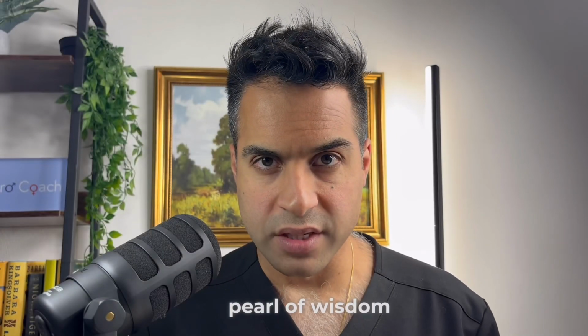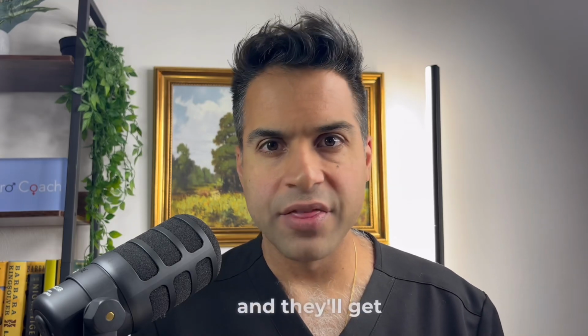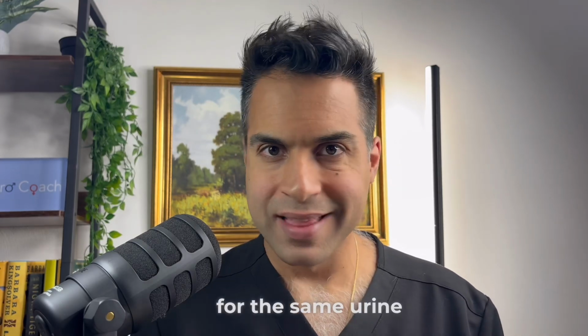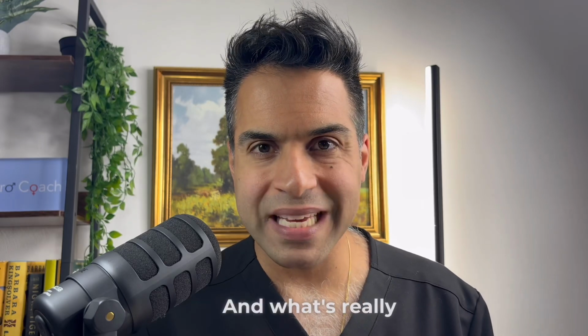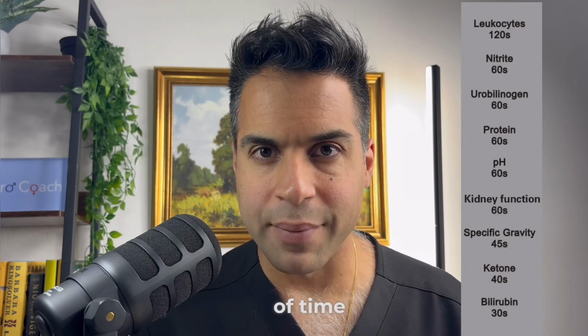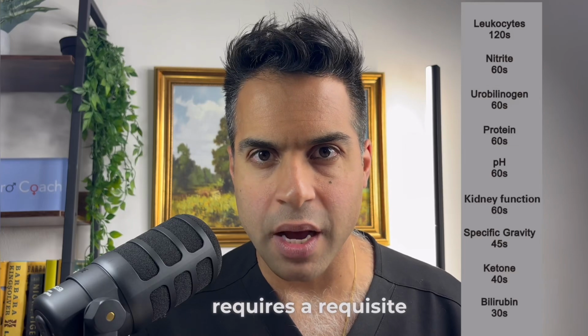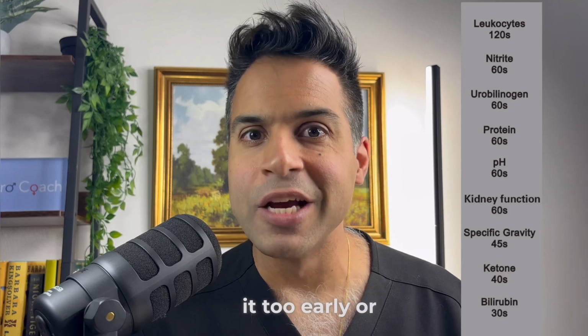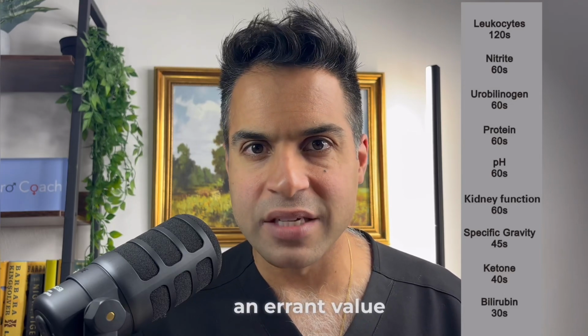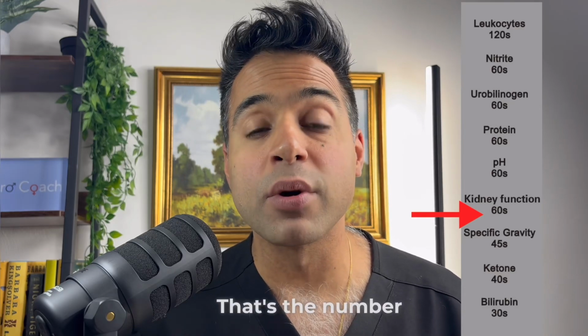And this is my pearl of wisdom. So when you see a urine dipstick, some people will look at it and they'll get multiple different values for the same urine specimen. And what's really key is if you look at this diagram here, you have to make sure you wait the right amount of time. Each one of the values that we are measuring on the urine dipstick requires a requisite amount of time before you can interpret it properly. If you try to interpret it too early or too late, then you may get an errant value, okay? So you see that number with the letter S next to it? That's the number of seconds you have to wait to interpret it properly, and that's super important.